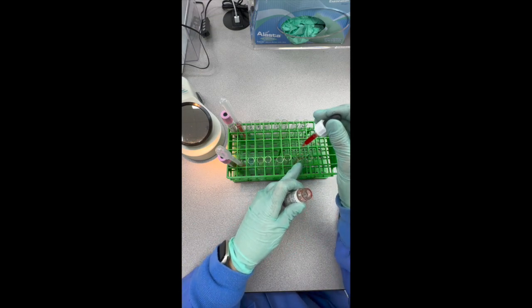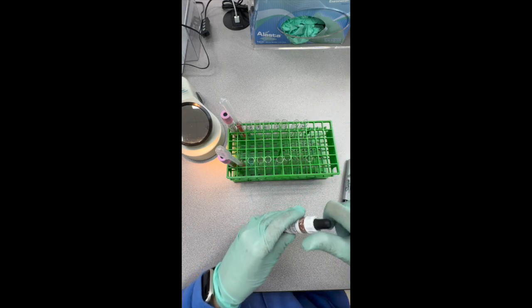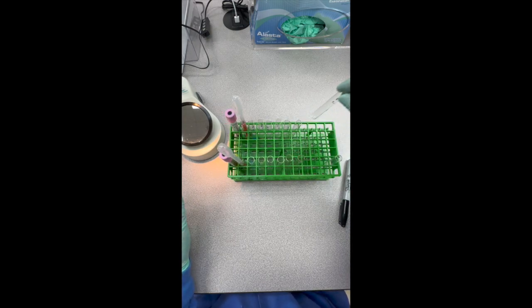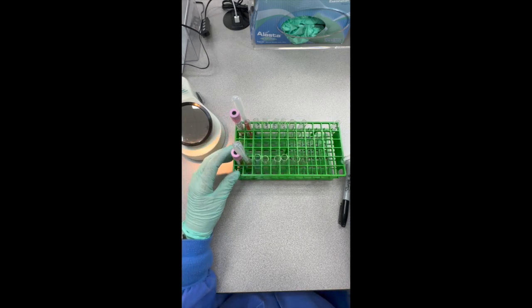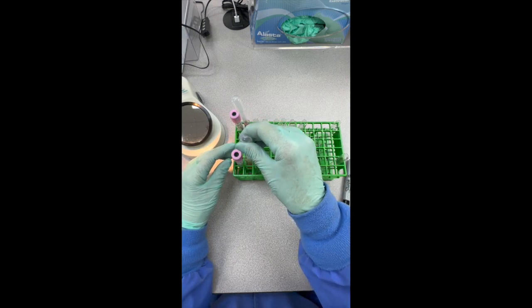And then one drop into our B. Because it's a habit that I make a patient tube for my cell suspension when I set up my tubes, I went ahead and labeled that even though I already had it ready here. That's okay. We're just ahead of the game.